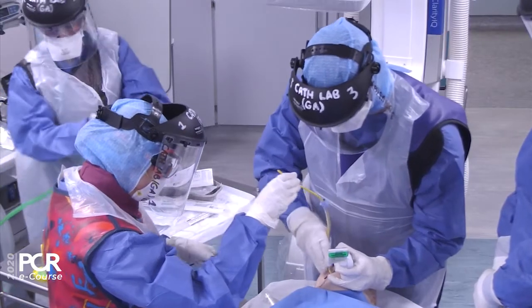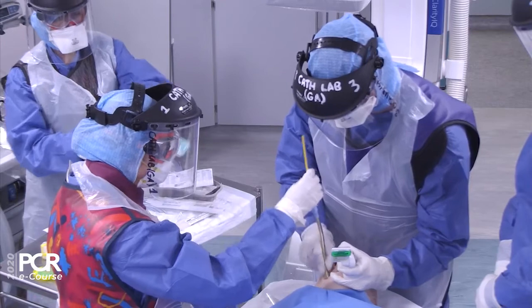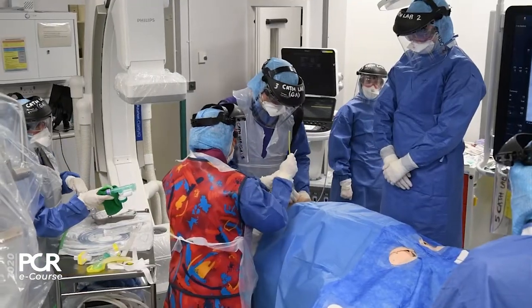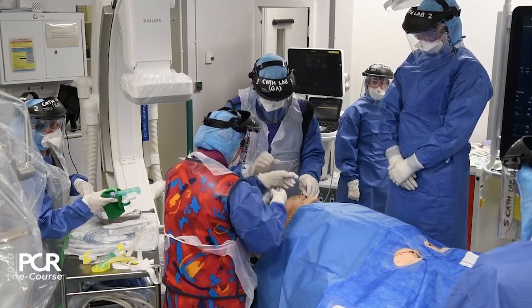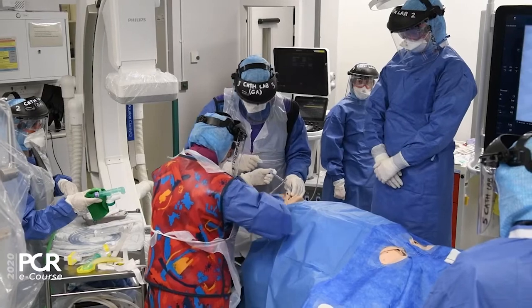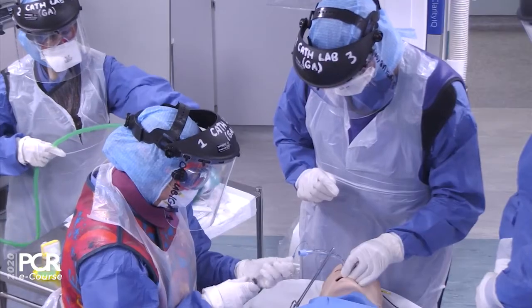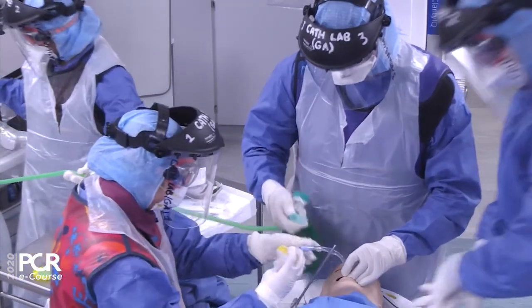You got the wire balloon ready? Yep. Fantastic. As soon as they're done, we'll get the camera back in. Continue CPR. Okay, CPR start.